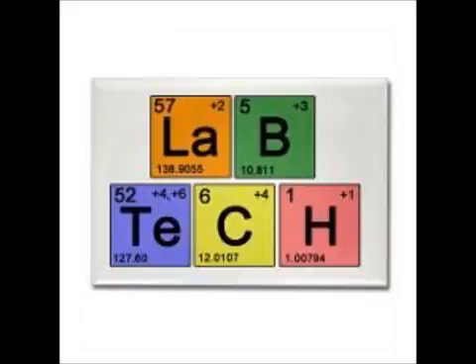So did this correct? Adsorbed plasma. So that eliminates those, right? If those don't help and it doesn't make it any better, you eliminate those from the normal. So what was in the aged serum of these 4 factors? Factor 9. If it was factor 8, what would have corrected? This would have corrected. Remember, that's how we distinguished hemophilia A and B on your last test. It would have corrected here 32 seconds, and this would have been 50.